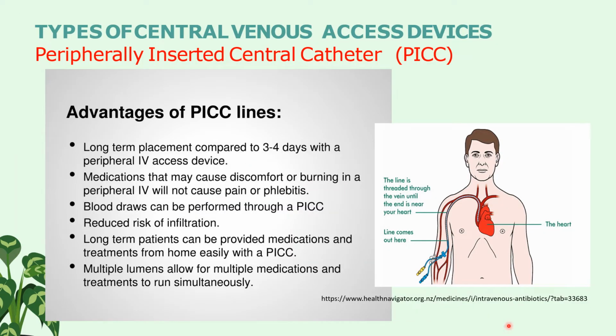So, the advantages of using PICC lines include the following. This can be used for long-term placement compared to 3 to 4 days with a peripheral IV access device. It can also be used to administer medications that may cause discomfort or burning in the peripheral IV site because this will not cause pain or phlebitis.